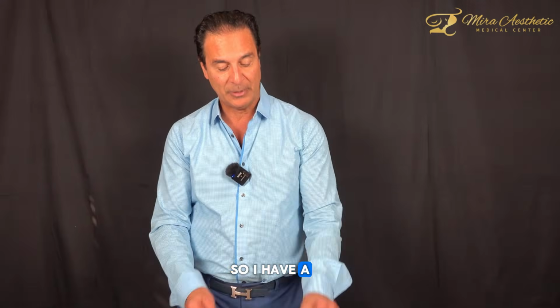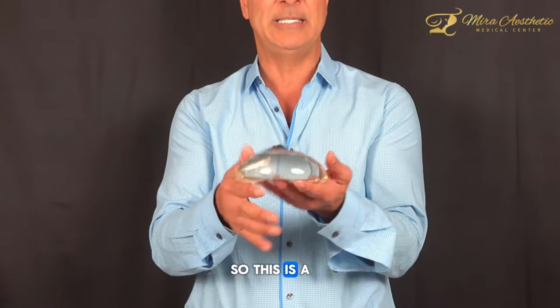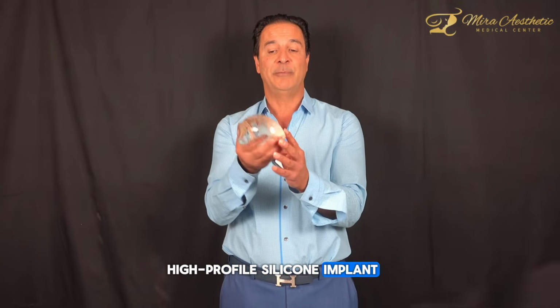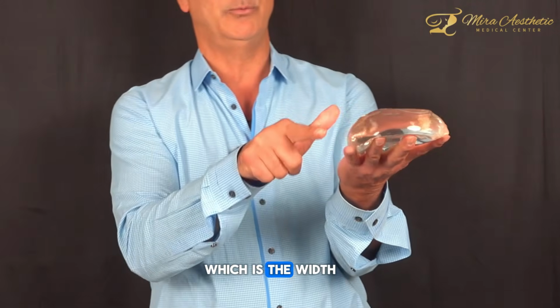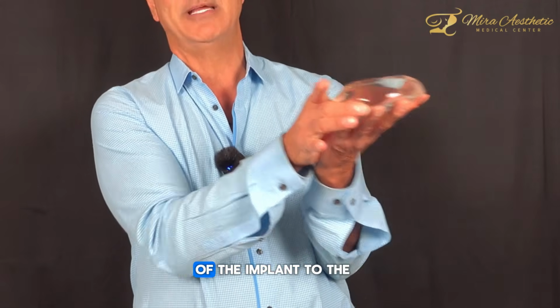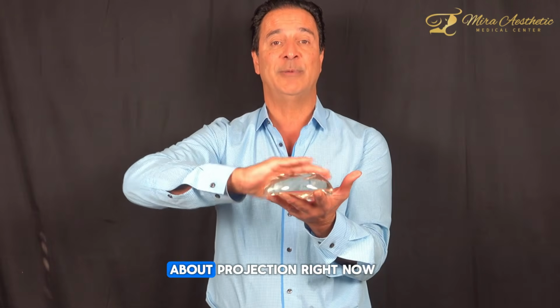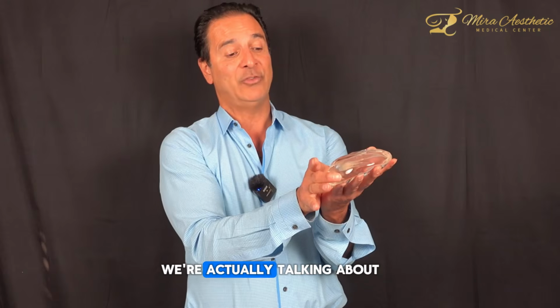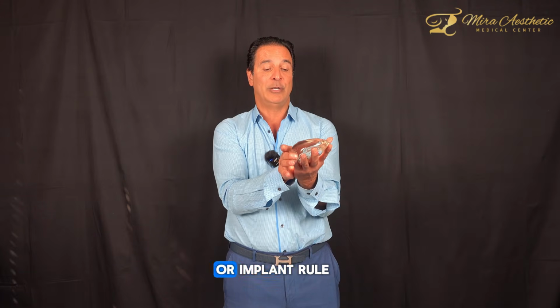I have a couple of implants. That also depends on the types of the implant. So this is a high profile silicone implant. You can see the implant has a diameter, which is the width, or the distance from one side of the implant to the other side. It also has a projection. We're not talking about projection right now. We're actually talking about the width when we're talking about the 45-55 boob rule or implant rule.